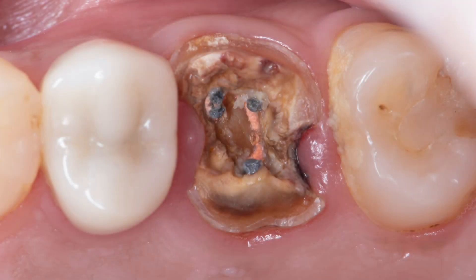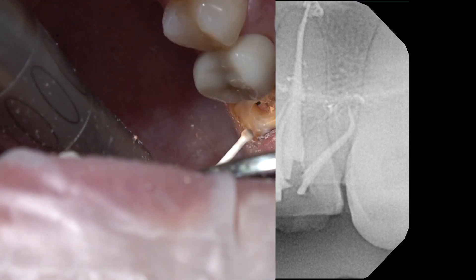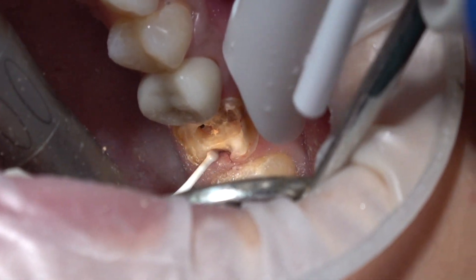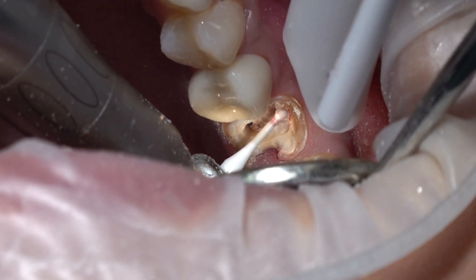Hello, my name is Dr. Ginny Bender, and I'm a general dentist at Glidewell. With Glidewell's digital in-office solution, I can fabricate my first BioTempNow and BruxerNow computer-automated design and manufactured crowns chairside.